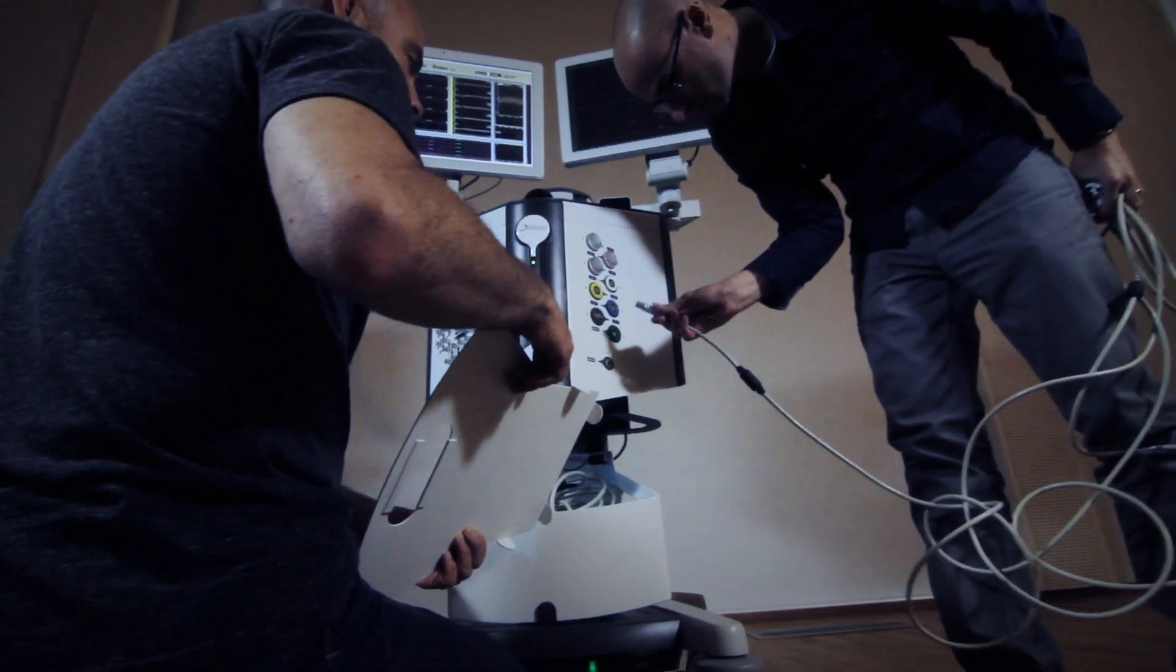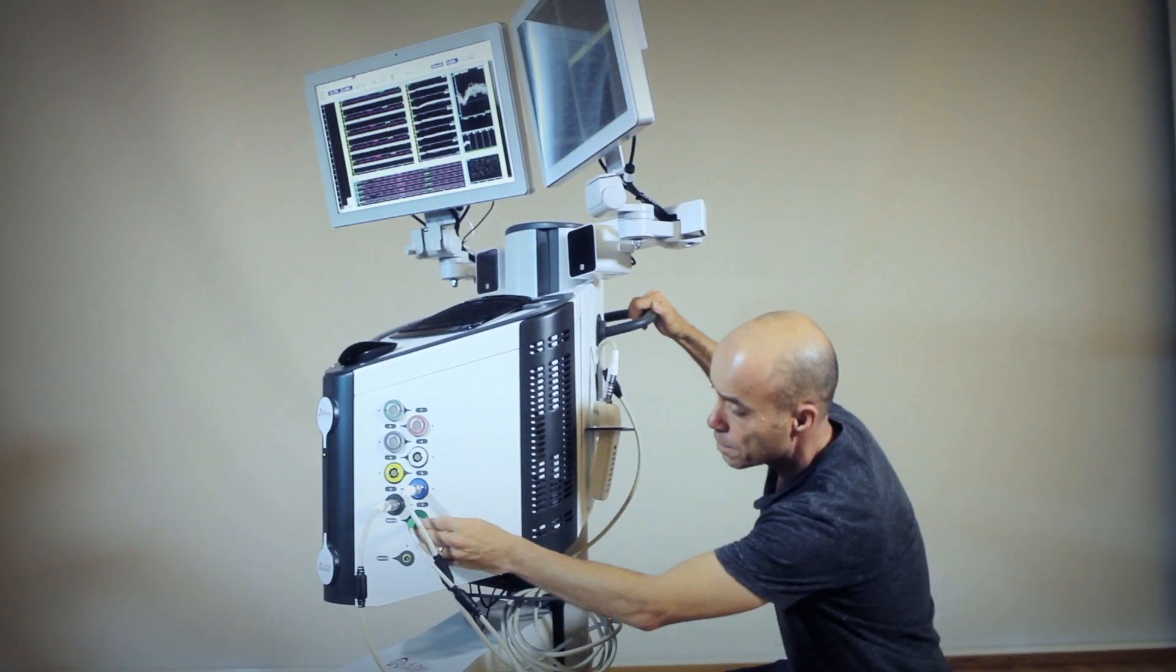I think that the product design best tells this story, from a lack of control for the doctor to being in full control. This is the subconscious message that the design conveys. We are here, we know what we're doing, and we will help you.